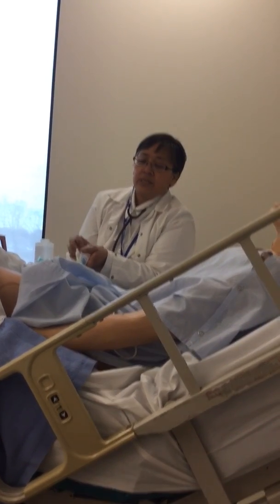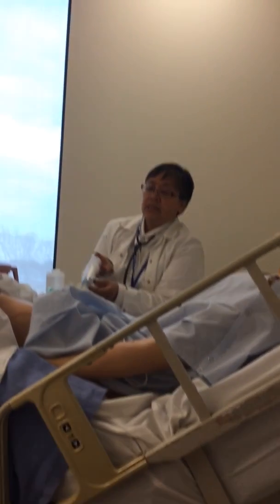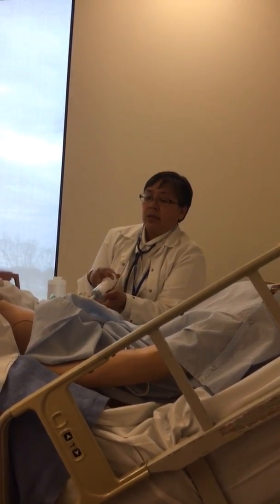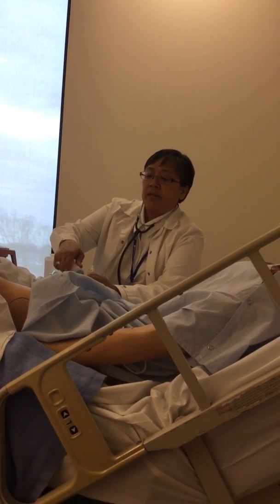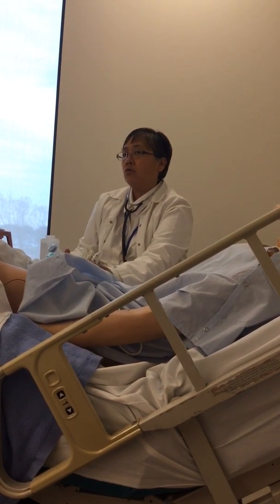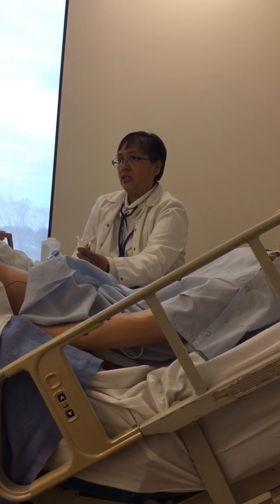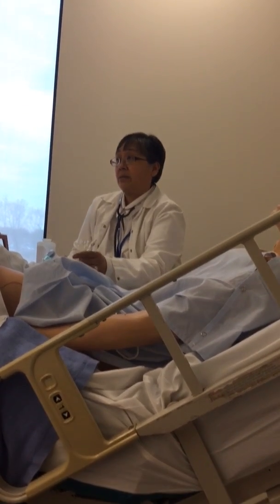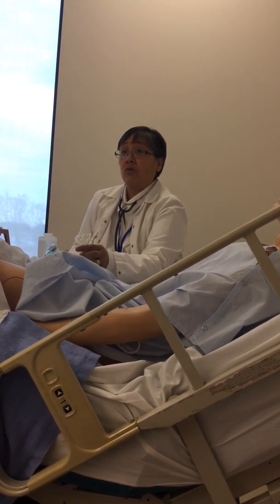So I'm getting the resistance, and so I've got maybe 5 cc's of residual, then I'll push this back, and now I'm going to get ready for my medications. Every time you leave the patient's bedside with an NG tube, you need to put that clamp on because you're going to have a bloody mess. Okay, it's going to be all over you.